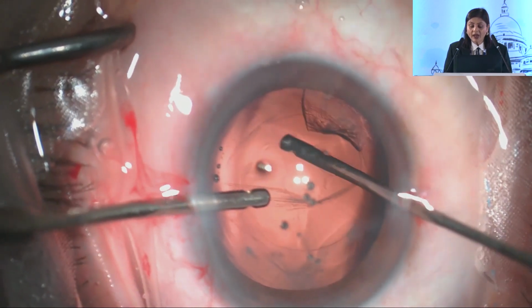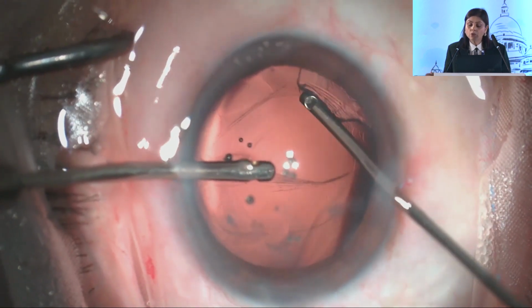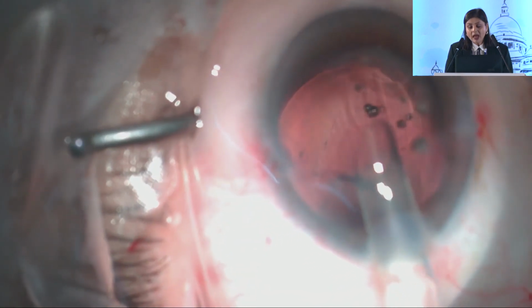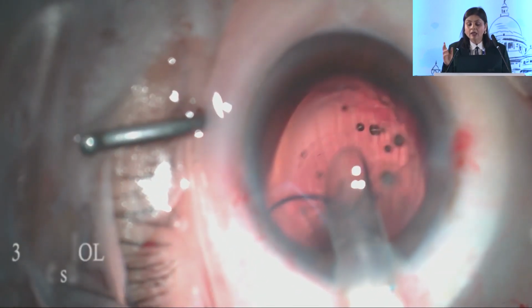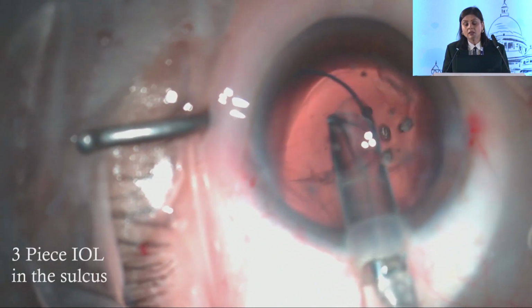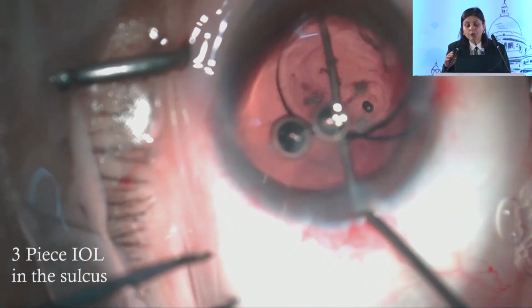So again, going ahead with vitrectomy, ensuring that we don't have any vitreous in the anterior chamber. We can use diluted triamcinolone if needed in these cases to visualize the vitreous better. And then here, because we had a decent sized PCR, we don't want to put the IOL in the bag, and we have shifted to a 3-piece IOL in the sulcus.